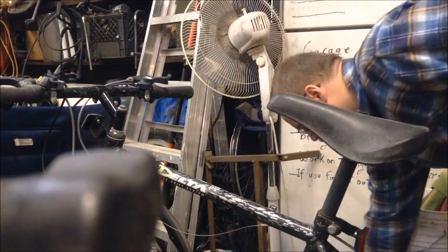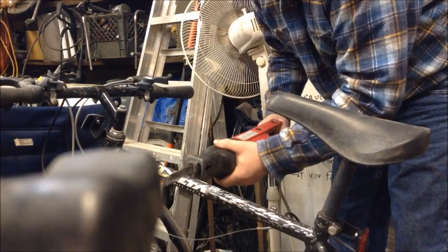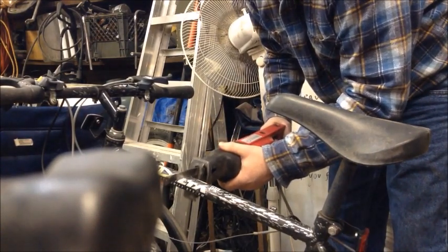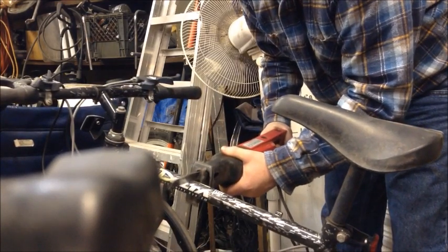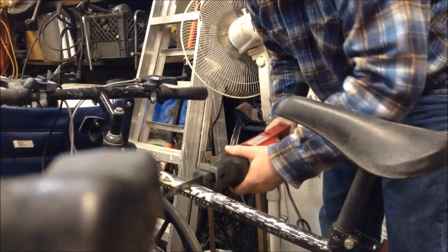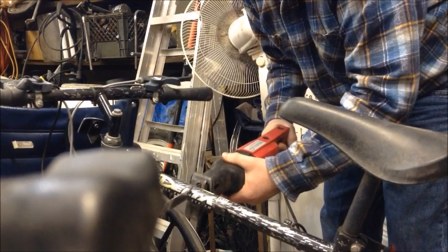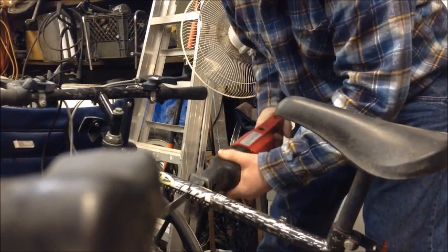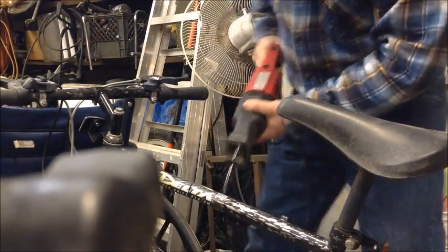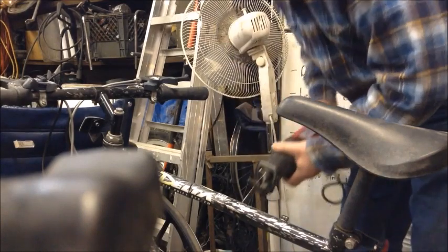So, we could use a handsaw to do this, or we could just use the power saw and get it over with. Ready? This isn't a very good saw. Alright, so it's cut through there.